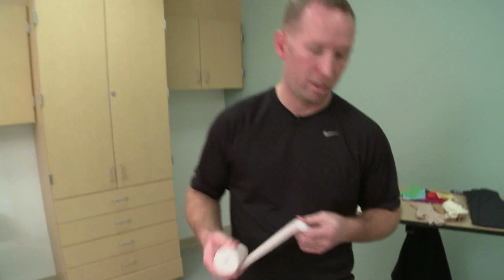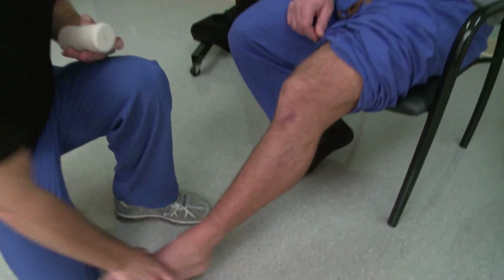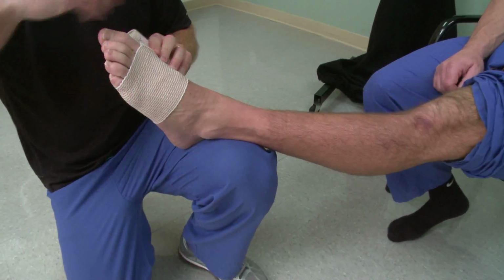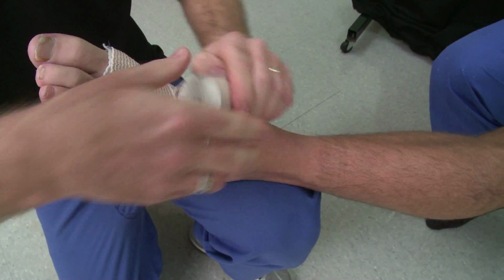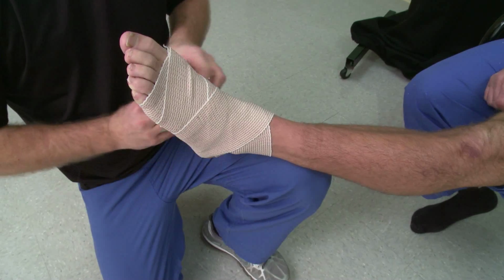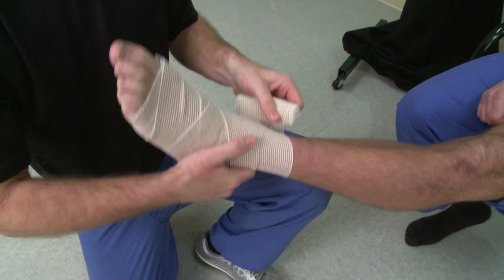I'm going to demonstrate proper ACE wrap placement on our patient. Is that okay? Yes. All right. So as you can tell, I'm rolling it on at the same level as I pull. That assures that the compression is even throughout.